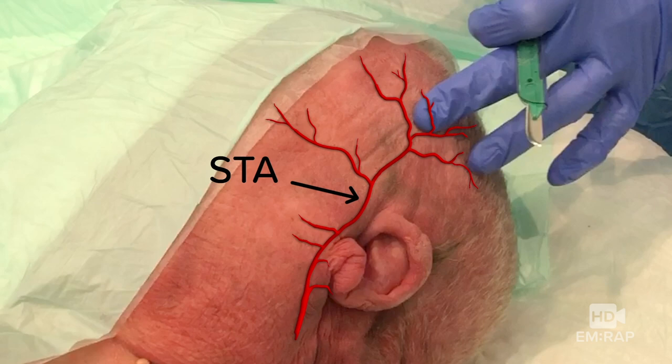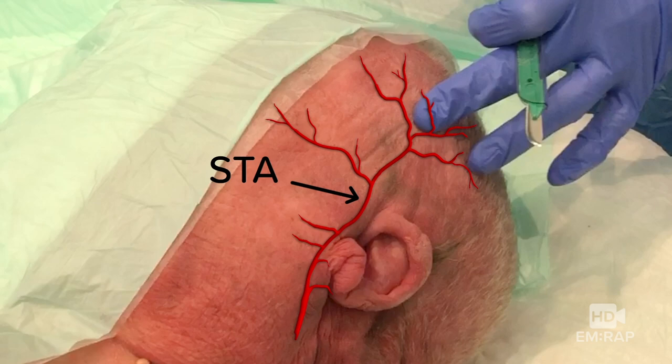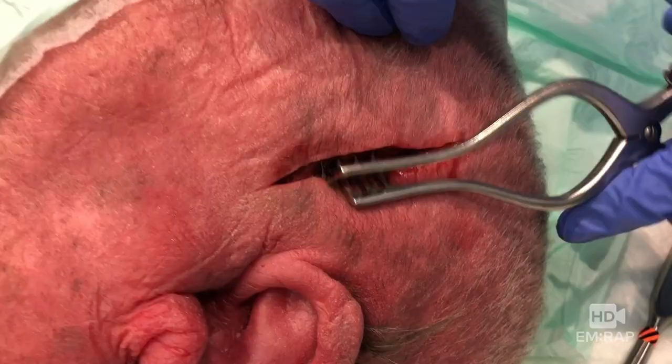Prep and drape your site and now make a 3–5 centimeter incision all the way down to bone. Insert the scalp retractor to expose the skull. The skull has three layers: the outer and inner tables are compact bone, and sandwiched between them is spongy bone.